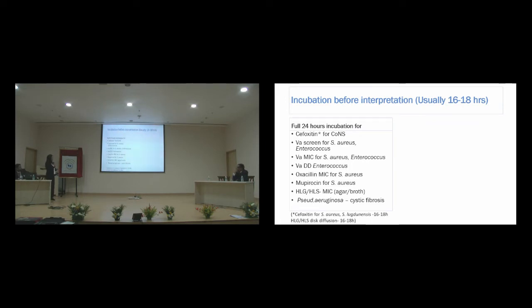For cefoxitin for Staph lugdunensis, 16 to 18 hours of incubation is good enough. And for HLG and HLS disc diffusion, 16 to 18 hours is good enough. There is also a note that if the clinician wants the AST report immediately and at 16 to 18 hours you find it resistant, you can still inform the clinicians. Whereas if it is in the sensitive range, a full 24 hours has to be incubated for all these conditions.